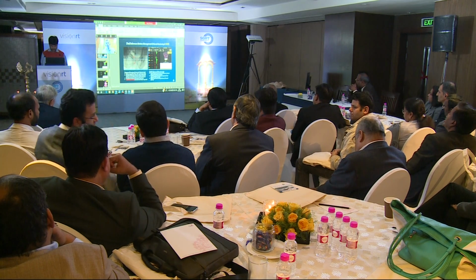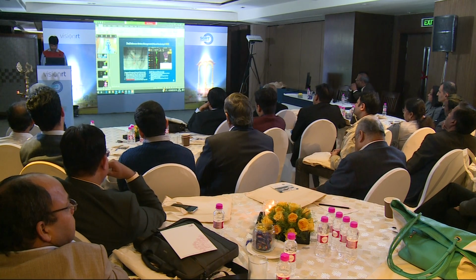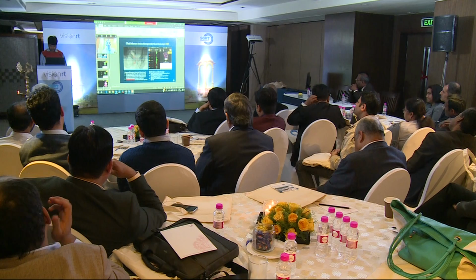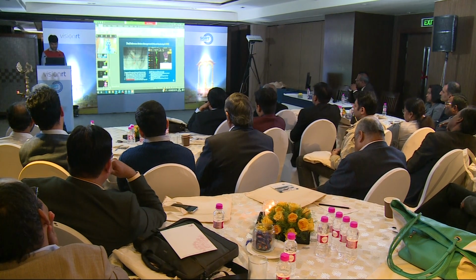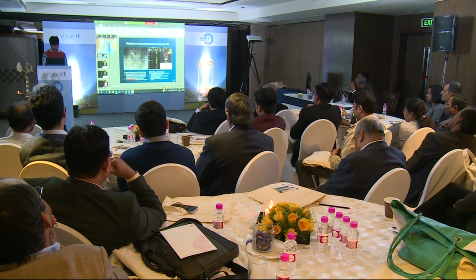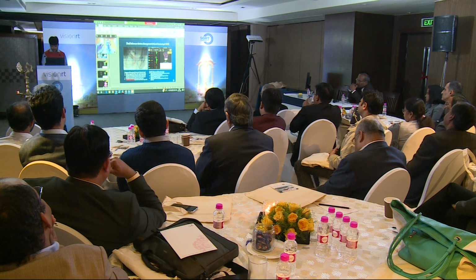We typically will place isocenter in the central fiducial, so the crosshairs here in blue are right inside that fiducial. As we're delivering our VMAT RapidArc treatment, we're actually watching the seeds or fiducials during the delivery, and if they ever migrate outside of those 2 millimeter spheres, we know we're beyond our 2 millimeter tolerance. If the patient is to move or adjust externally, the AlignRT system gates the beam, turns the beam off immediately.